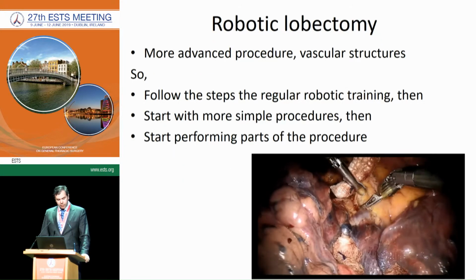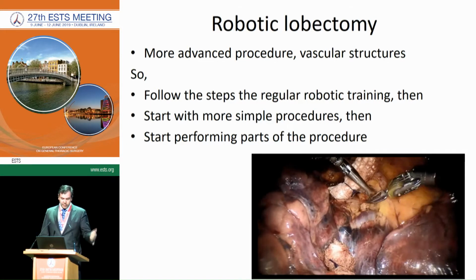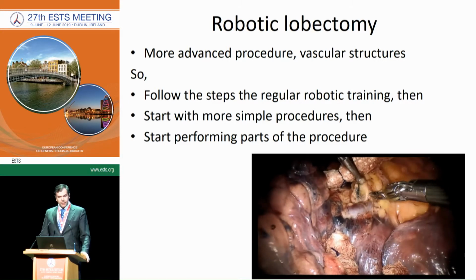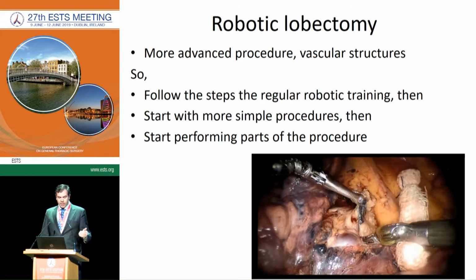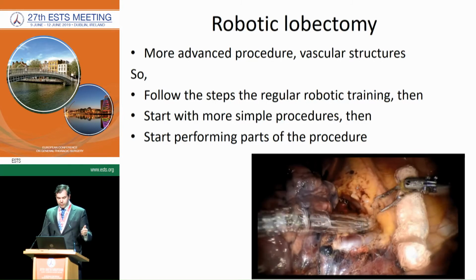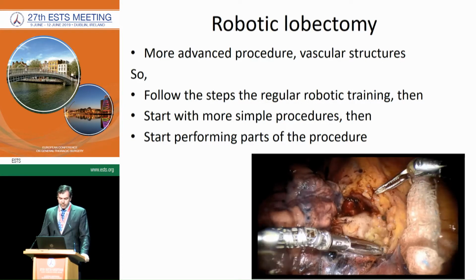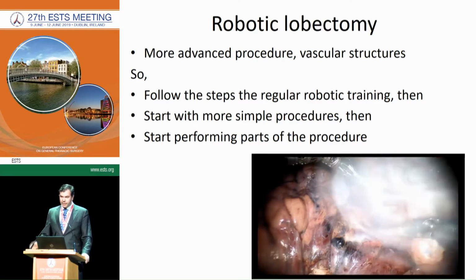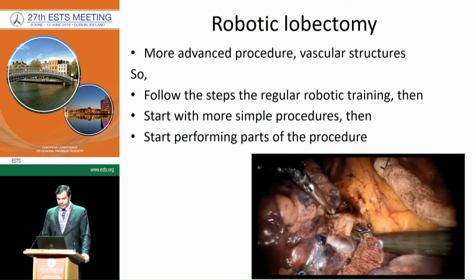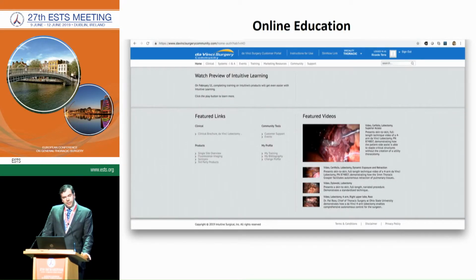Robotic lobectomy in particular is a more advanced procedure when you are teaching robotic surgery. Because of vascular structures, as we see here, we are dissecting the pulmonary artery. So we should follow all the steps with the residents from a regular robotic training perspective: online education, simulation, starting with simple procedures and then moving on to performing parts of a lobectomy, and then finally letting them pass behind the artery, as we are doing here, without having a heart attack. And these are the resources we have.